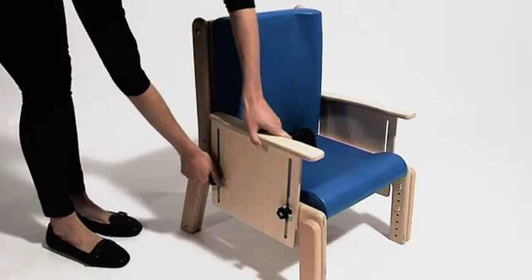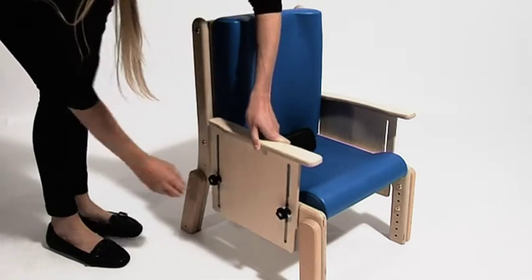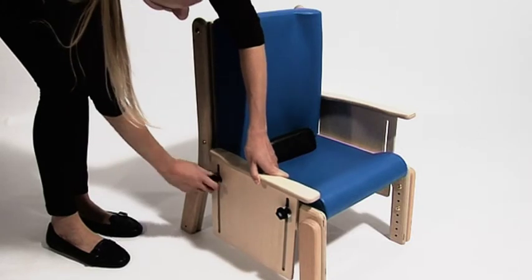To adjust the height of the armrest, loosen the hand wheels, slide the armrest to the desired position and then re-tighten the hand wheels.